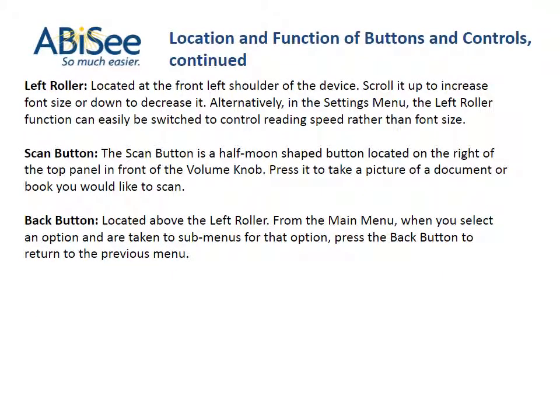Location and function of buttons and controls, continued. Left roller: located at the front left shoulder of the device. Scroll it up to increase font size or down to decrease it. Alternatively, in the settings menu, the left roller function can easily be switched to control reading speed rather than font size. Scan button: a half-moon shape button located on the right of the top panel in front of the volume knob — press it to take a picture of a document or book you would like to scan. Back button: located above the left roller. Press the back button to return to the previous menu.